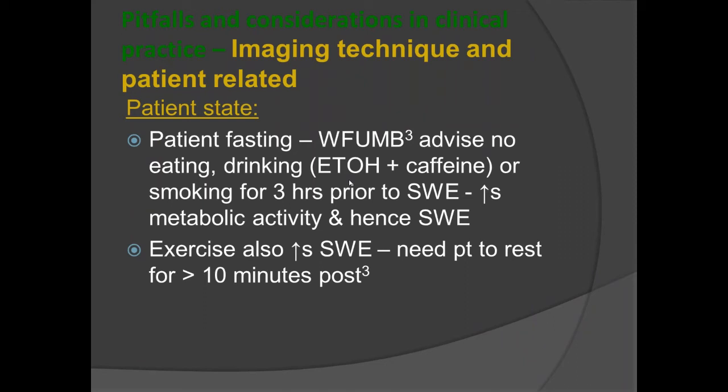We always ask our patients to fast, but unfortunately it's not always possible that people abstain from alcohol, especially as outpatients. So we just ask patients to fast for 3 hours as outpatients to reduce the level of metabolic activity, because any metabolic activity, be it digestion or smoking, will artificially increase your shear wave, as will exercise.